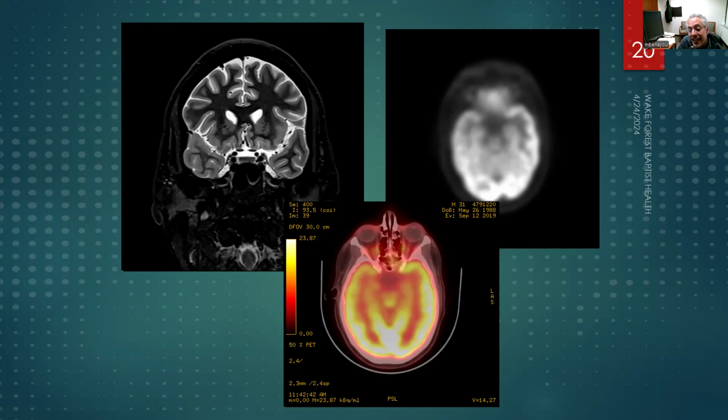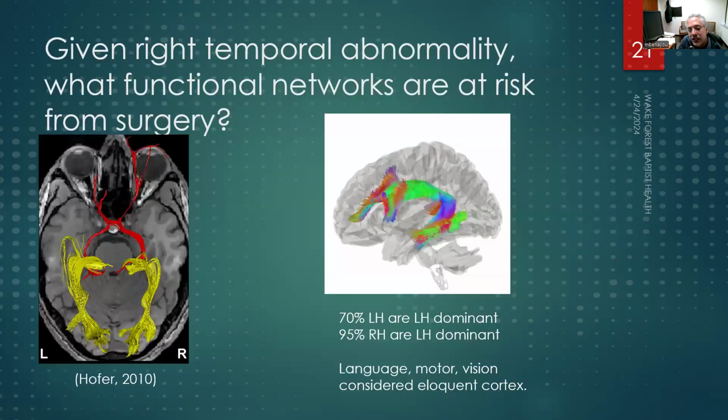And so we can take advantage of the fact that the rest of the brain is highly metabolic for glucose to try to look for areas that are interictally hypometabolic as a sign of finding a seizure focus metabolically. So we have anatomic, we have metabolic, we have EEG with electrophysiologic, then we have this perfusion metric with fMRI. And so we're putting together all these different pieces of the puzzle. And then just one more quick anatomic imaging, and we'll get back to fMRI.